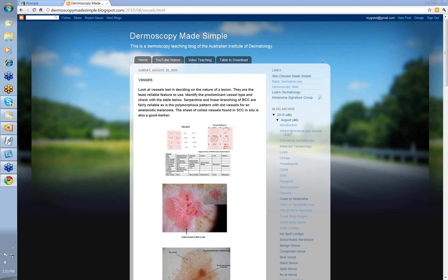My name is Ian McCall and this is a video from the Dermoscopy Made Simple series on vessels. Look at vessels last in deciding on the nature of a lesion. They're the least reliable feature to use when you're looking at a dermatoscopic view. What you should do is identify the predominant vessel type and check the table. There are a few vessel types that are of some importance.